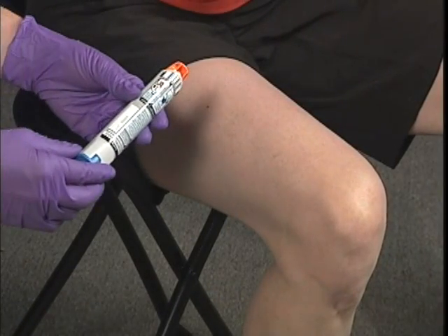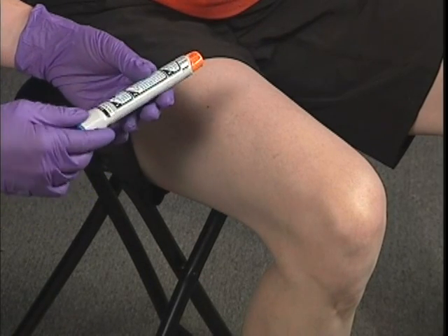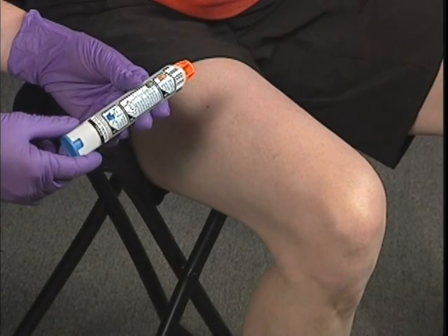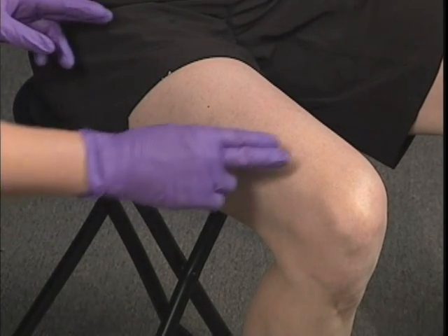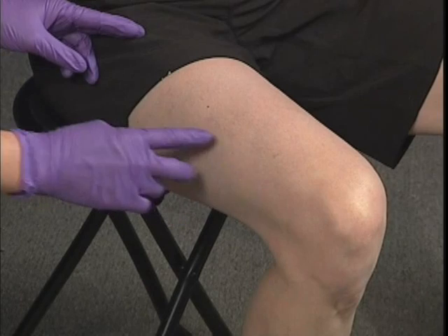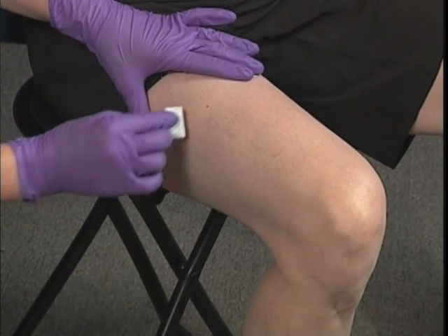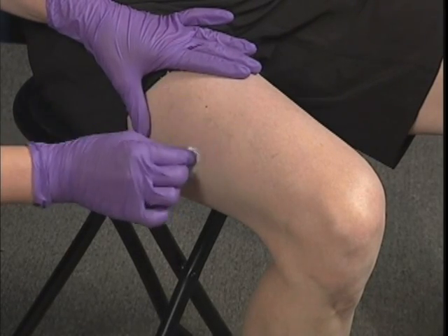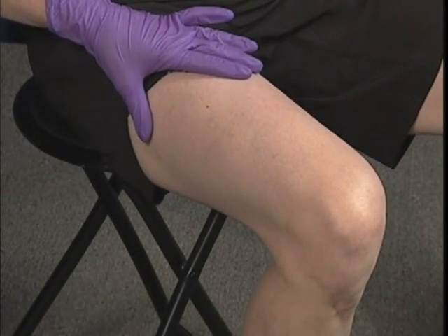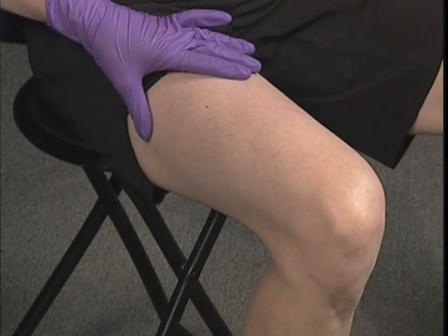When administering medications with an auto-injector, remember to recheck the medication for the patient's rights. Select an injection site, right or left vastus lateralis, commonly called the lateral thigh. Cleanse the injection site with an alcohol prep or other suitable antiseptic swab in an outward circular motion for about 2 inches. Allow the swab spot to dry for approximately 30 seconds.